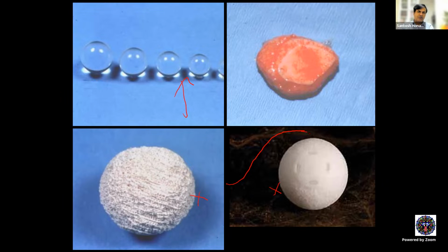Finally, in the late 1990s and 2000s, there was a slide. Now it has settled down to a particular level where it is used only in patients who understand that these implants have complications and are ready to take that risk for the sake of better prosthesis motility.